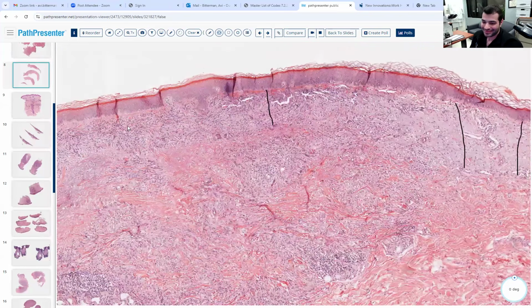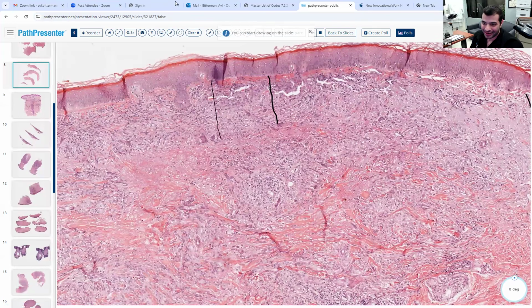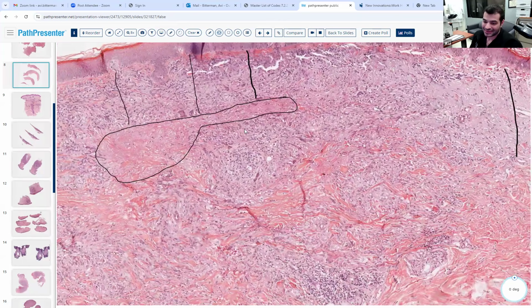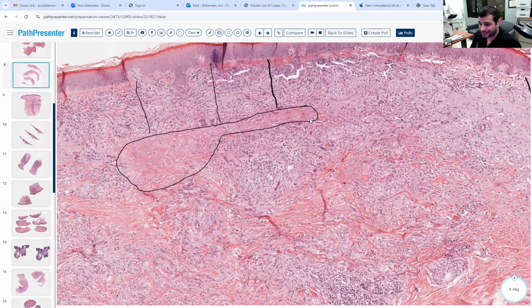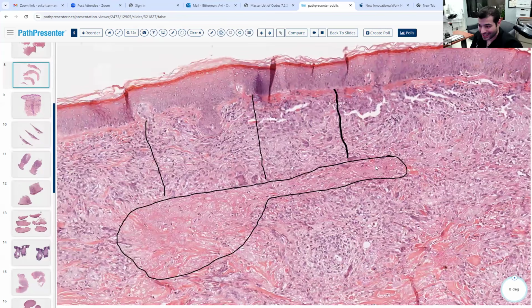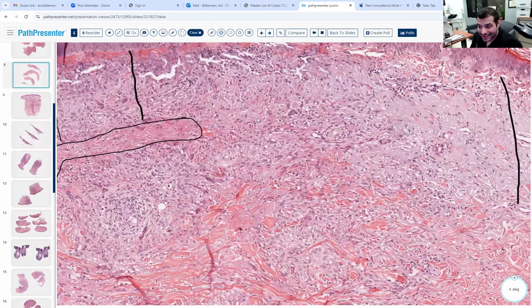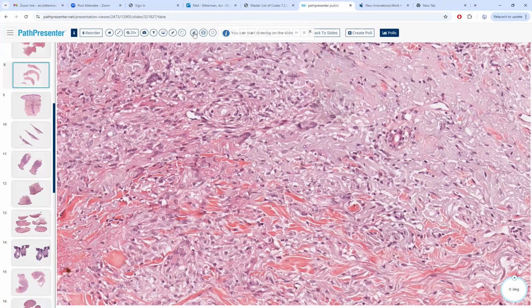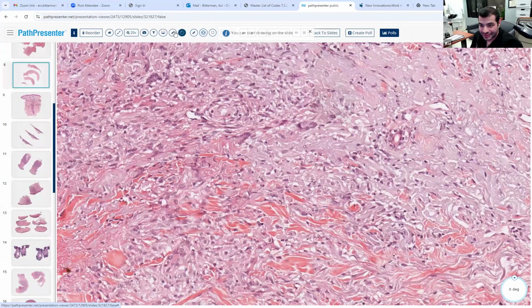So it's gone over here and it's gone over here and it's gone over here, right? So what happened over here? Something pushing it up. Well, something could be pushing or it could be eating it. Is it actinic granuloma? Actinic granuloma. And by the way, what kind of cell is this? Histiocyte, multinucleated. Yes, it's a multinucleated histiocyte.